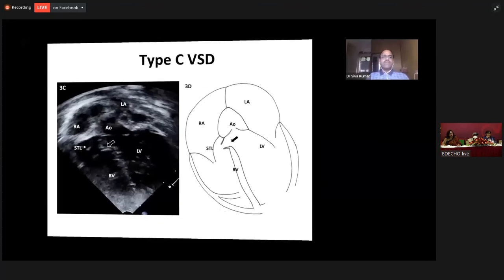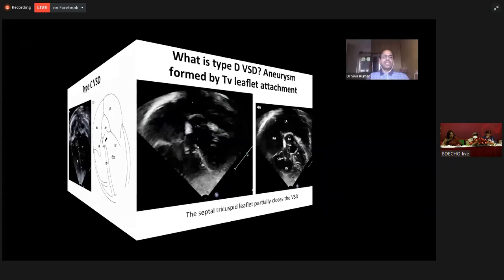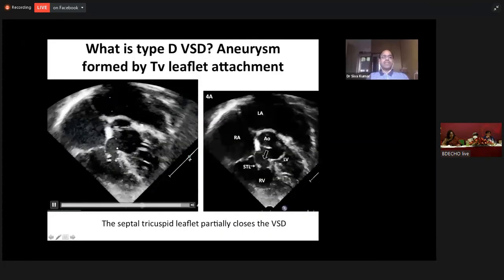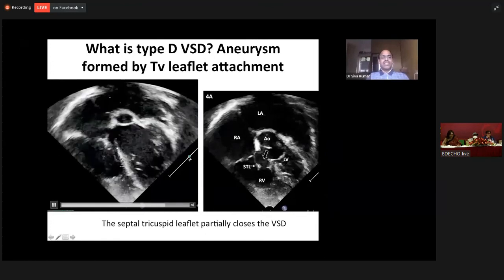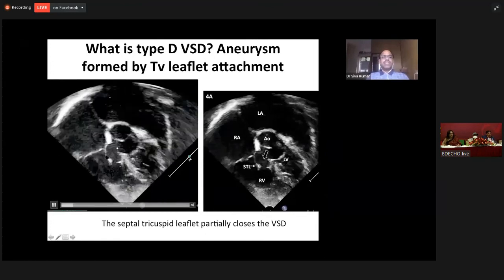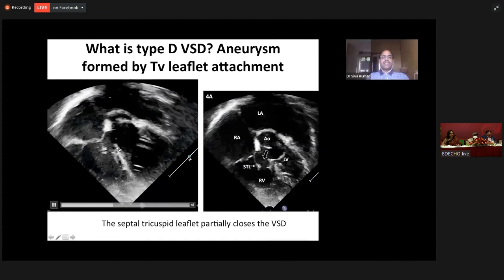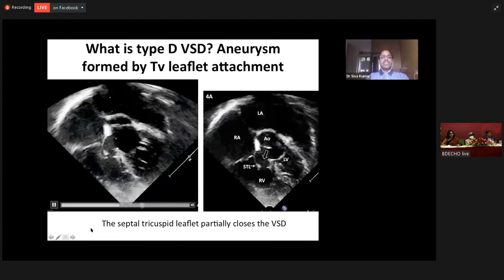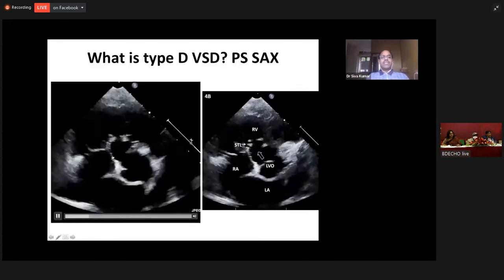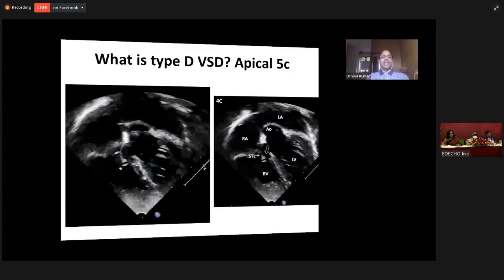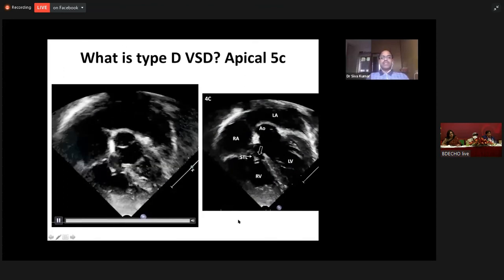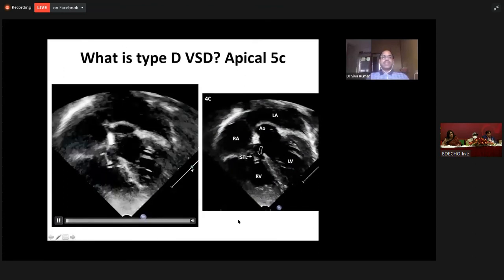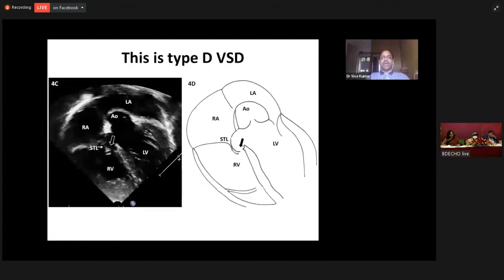The last type — type D VSD — is where the septal aneurysm itself is formed by the septal tricuspid leaflet. So the STL gets attached to the crest of the ventricular septum, forming the septal aneurysm. The aneurysm is formed by the STL itself. We can appreciate it here — the septal tricuspid leaflet is forming the aneurysm. And this is the apical four-chamber view where the septal tricuspid leaflet is forming the aneurysm. This last type is called type D ventricular septal defect.